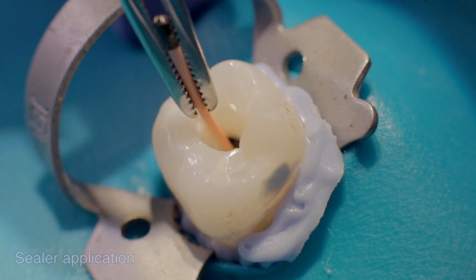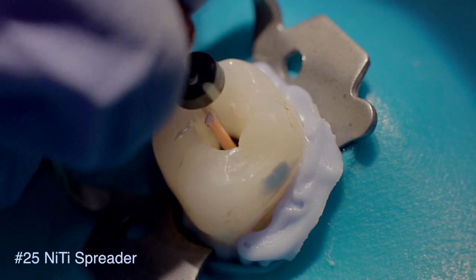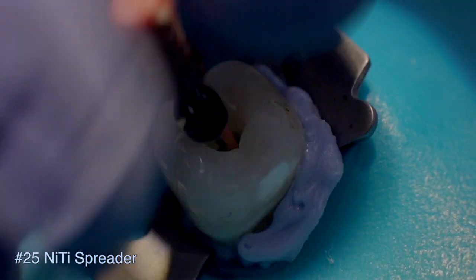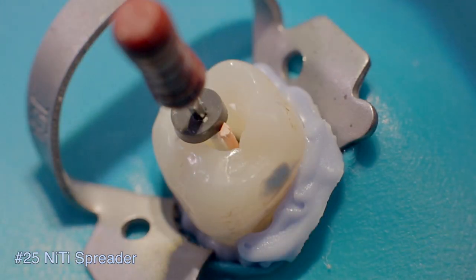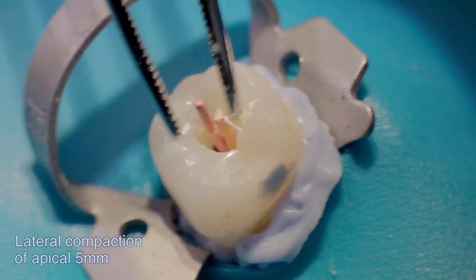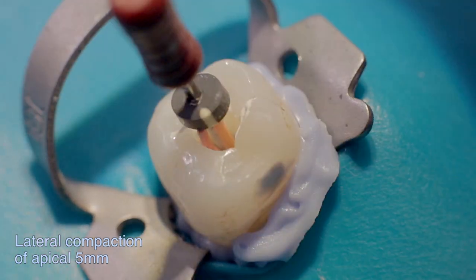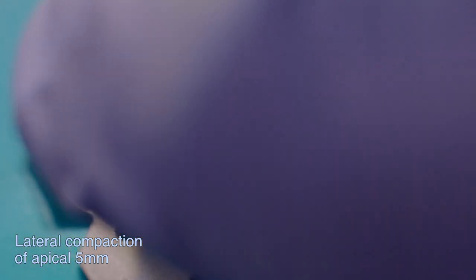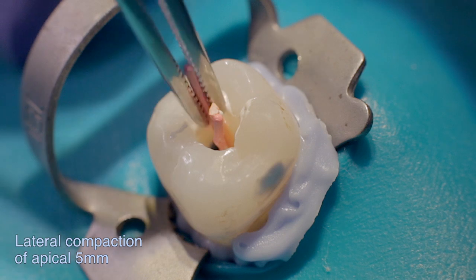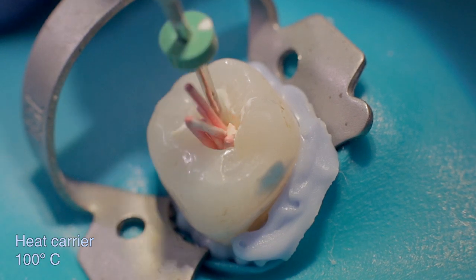The combination technique of obturation demonstrated here by Dr. Solomanov combines lateral cold compaction in the apical region with vertical warm condensation in the middle and coronal parts of the canal. This technique allows for better control of the apical region, avoiding excessive sealer extrusion.